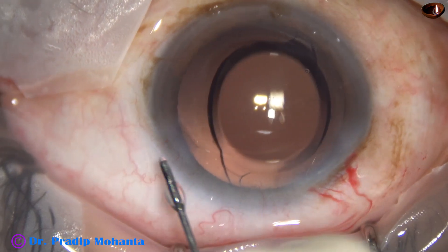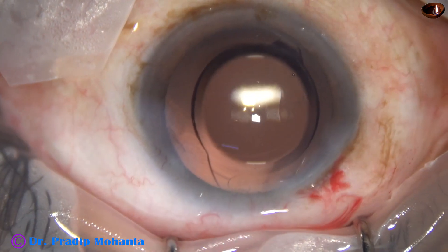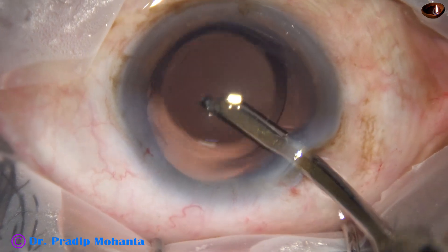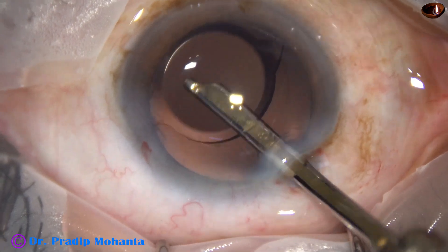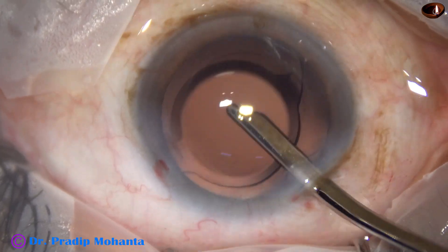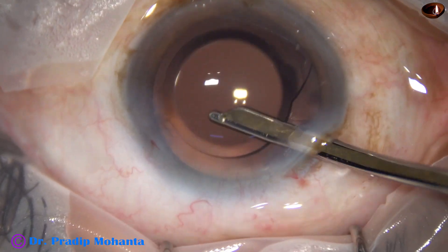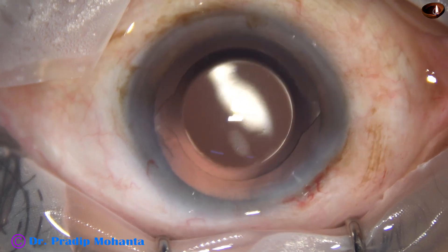And now I close this side port by hydrating the corneal stroma. If the wound is not stressed, we don't have to inject a lot of BSS into the corneal stroma — a little bit is okay. And now this is the final lavage of the anterior chamber. The space between the posterior capsule and the lens is irrigated and aspirated. The anterior chamber is irrigated and aspirated, and the lens is nicely positioned at the center. The anterior chamber is then formed. The Simcoe comes at the wound, and it is done. The patient is under topical anesthesia.